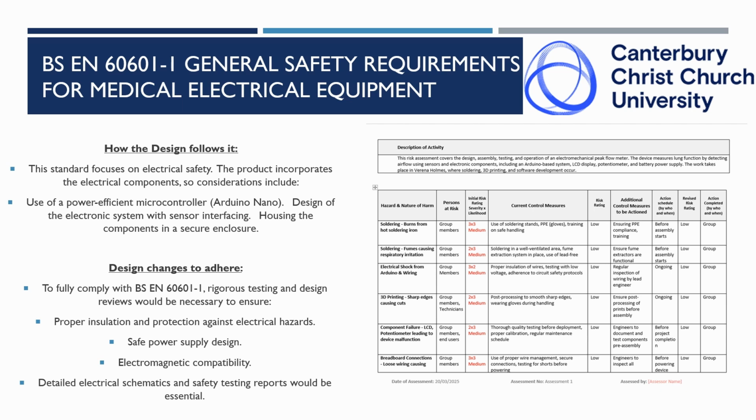Safe power supply. We're looking at using 9-volt batteries to properly house the device instead of having to plug the device into a power outlet or a PC. Electromagnetic compatibility. This is for use of our device within MRI suites or around electromagnets. And detailed electrical schematics for safety testing reports are essential in order to continue to apply and adhere to BS EN 60601-1.